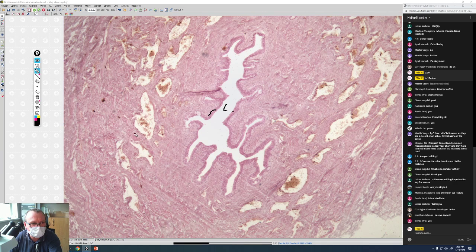In between, you can see some smooth muscle tissue which belongs to the wall of the urethra, because the urethra also has tunica mucosa, from the epithelium to this level approximately. Sorry for this very rough drawing, I have two rough hands. And here is the tunica muscularis. That means these cavernous spaces can be found in both these layers.